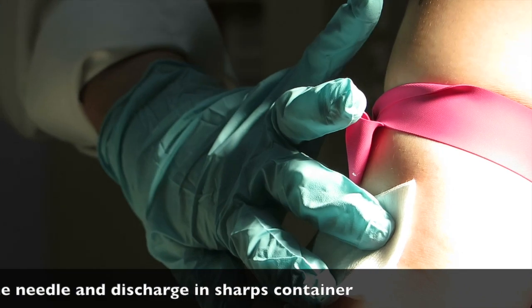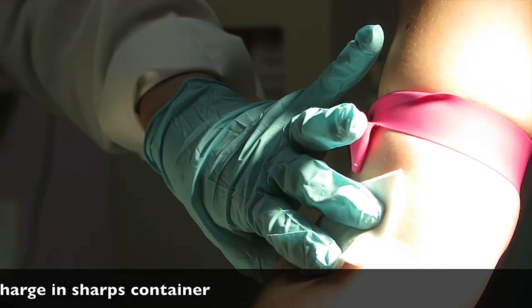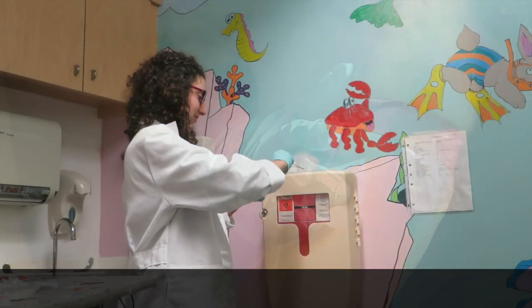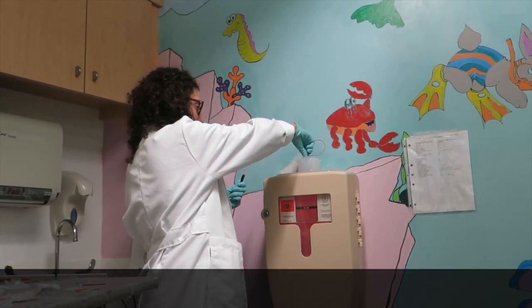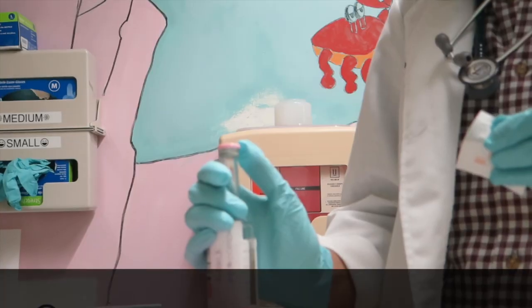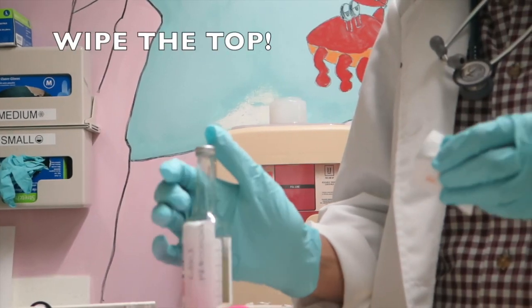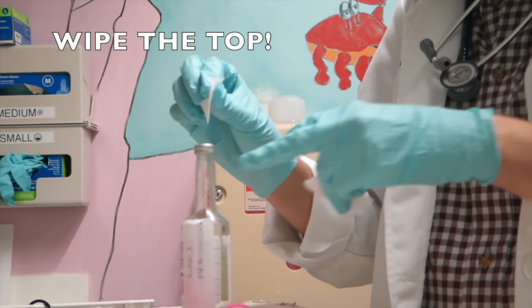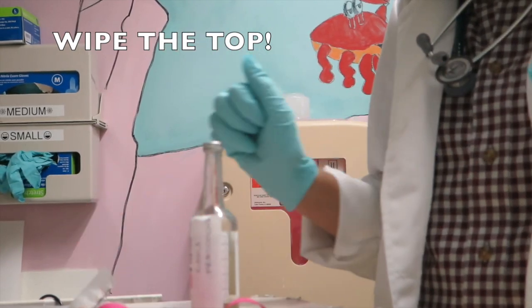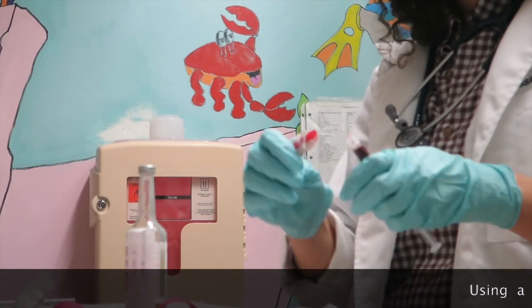Withdraw the needle and discard in the sharps container, or connect IV extension tubing as indicated. Remove the plastic covering on the culture bottle and wipe the top of the specimen bottle with alcohol prior to instilling the blood sample. Remember, the top of the bottle is not sterile.